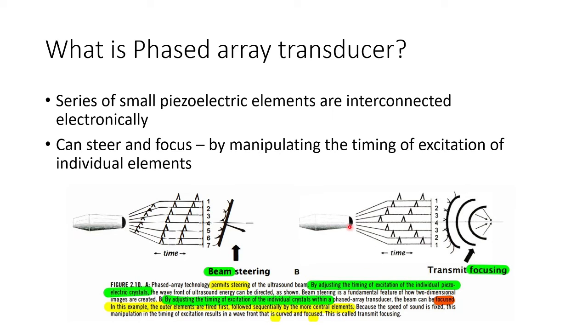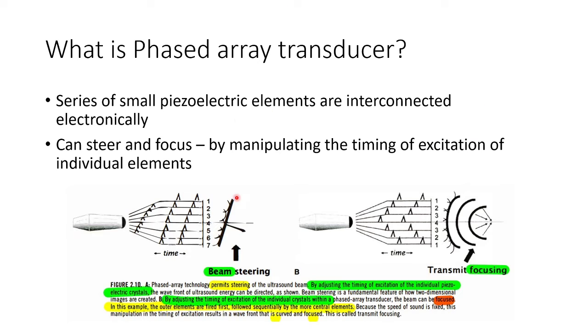And how does the phased array probe focus? They turn elements on after a limited amount of time, and thereby they focus the image at the center. So that is how they do it. These are just the basics of the physics; we need not know the details much.